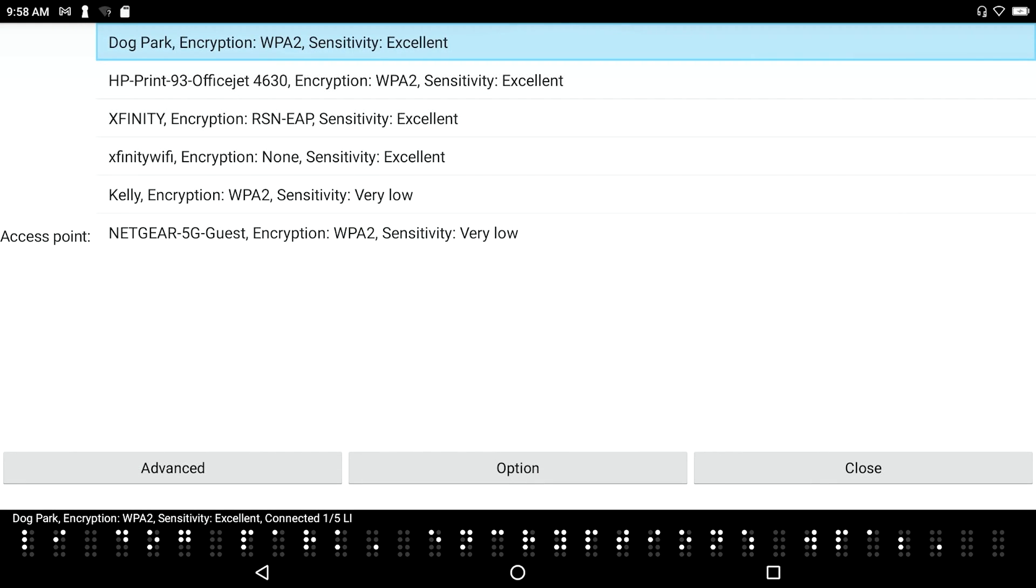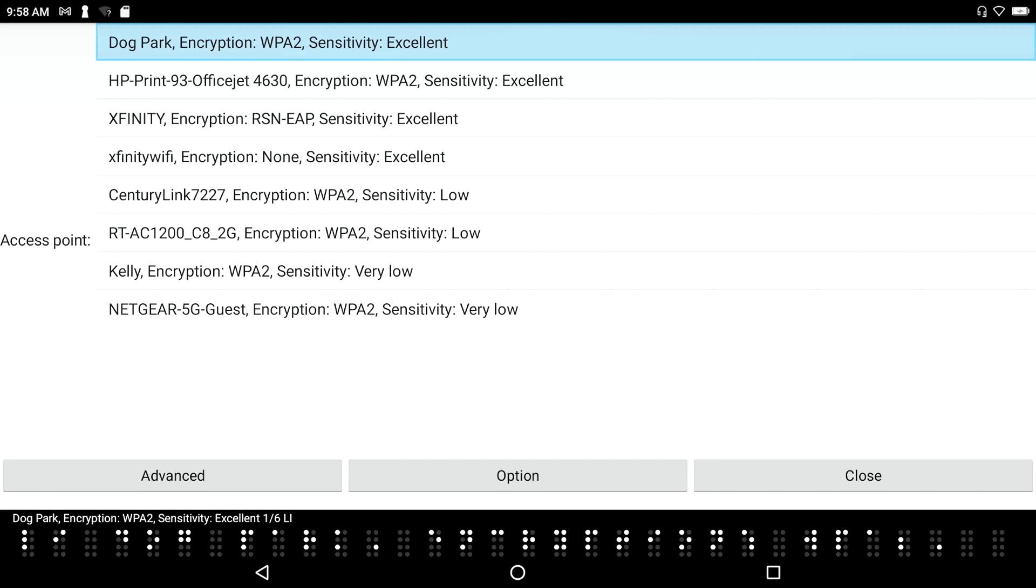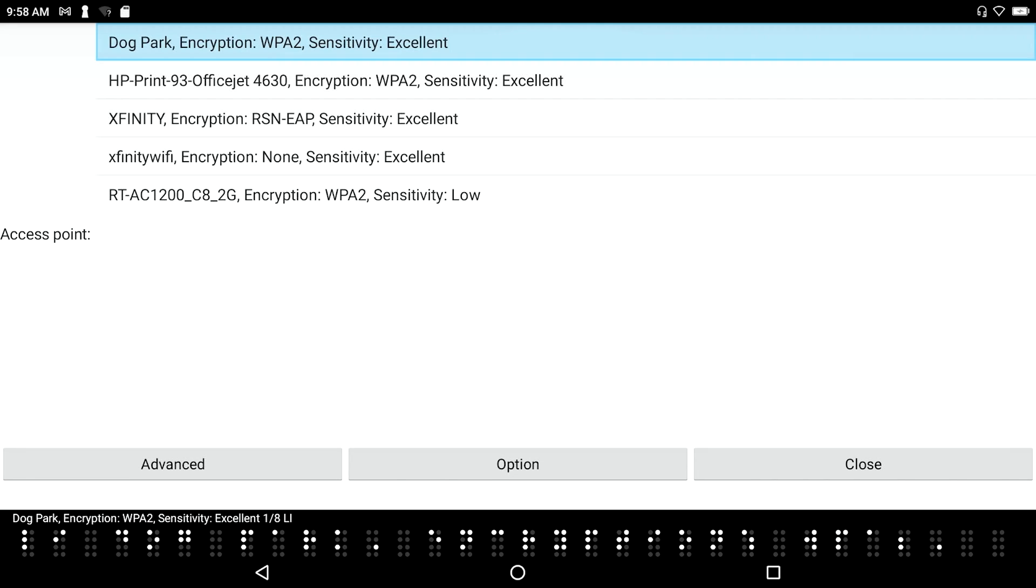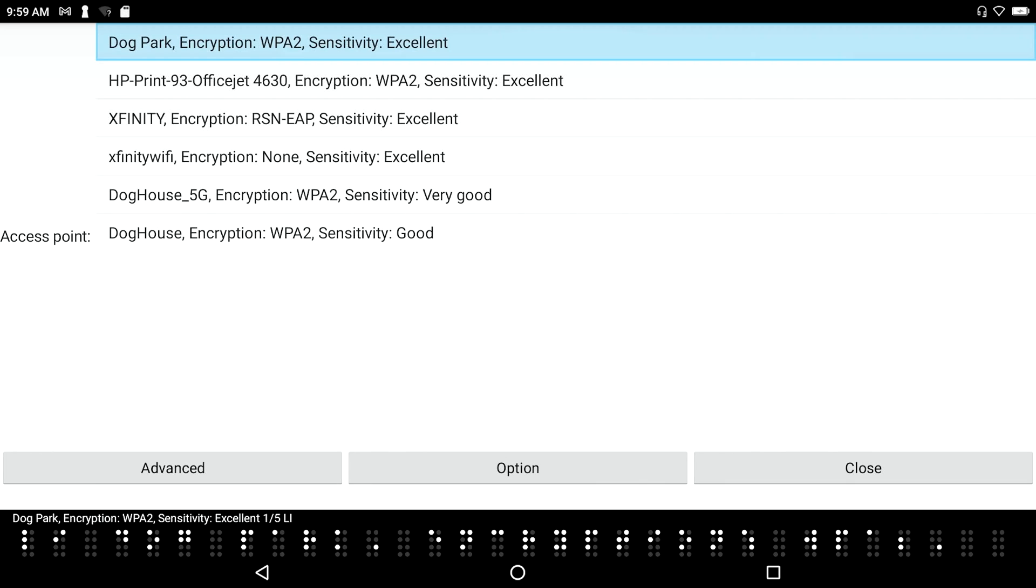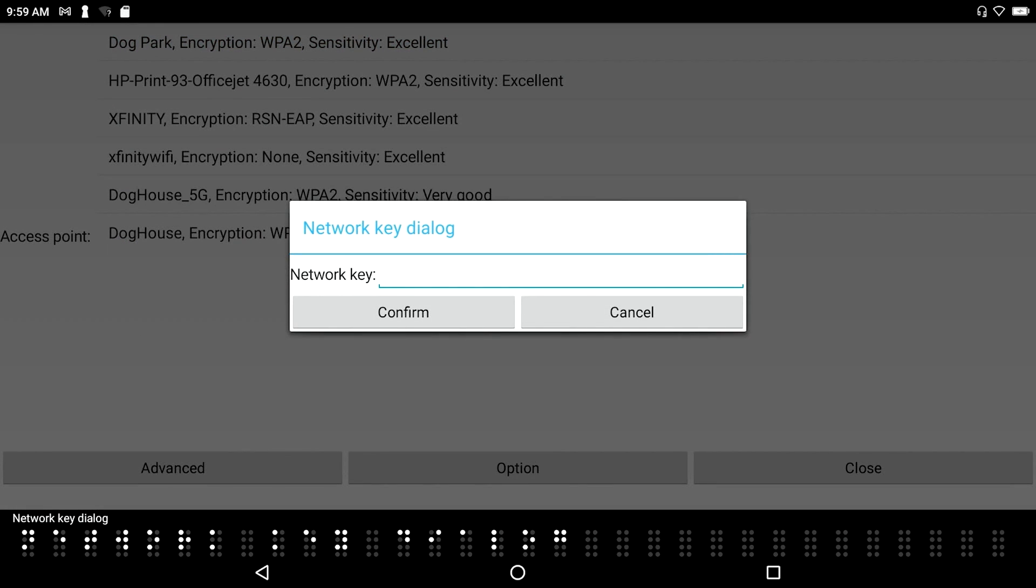Dog park. Encryption. WPA2. Sensitivity. Excellent. It took a second for it to catch up and realize that it's no longer connected to dog park. And now I see that the type of network that it is, WPA2, and that I have an excellent reception, but I'm no longer connected. So I'm going to press Enter on it.